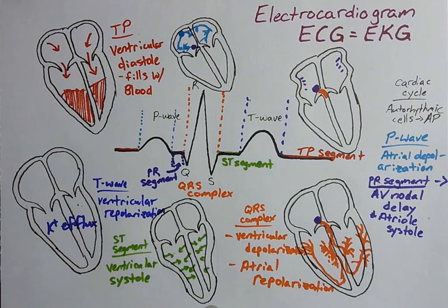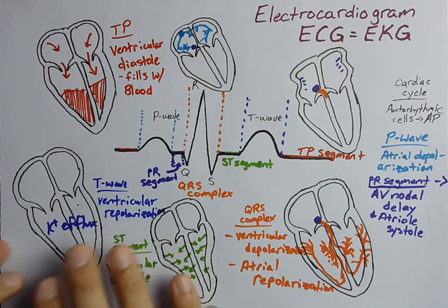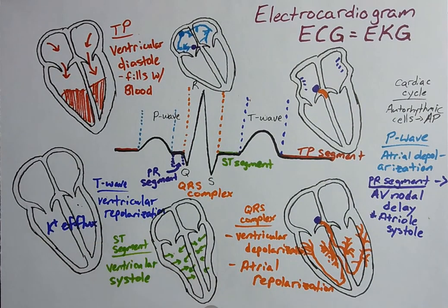All right, that's the EKG summarized. Hopefully that was helpful to you all that are going and frantically trying to study this material. I recommend drawing out the EKG. You don't have to draw out these hearts. They take a lot of time. Again, I'm not a very good artist, so it took me a long time to come up with these hearts.